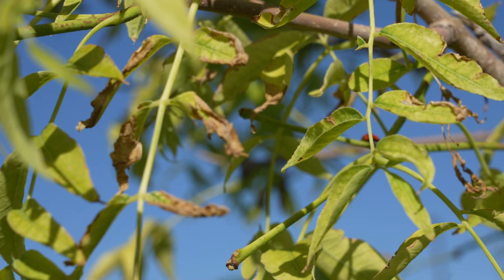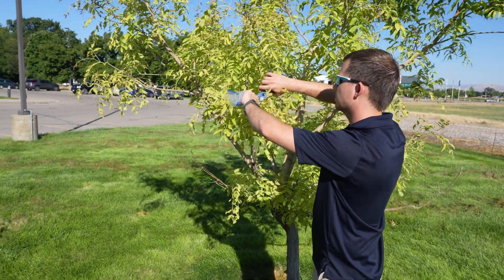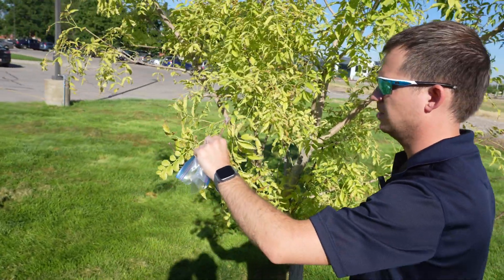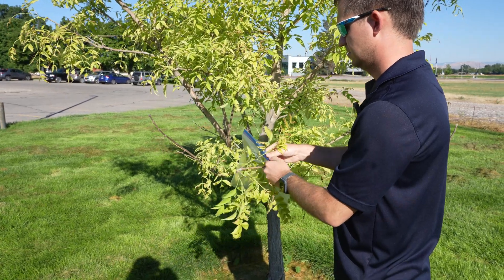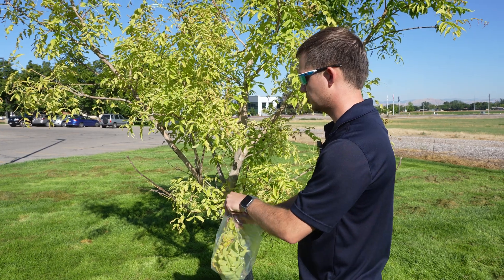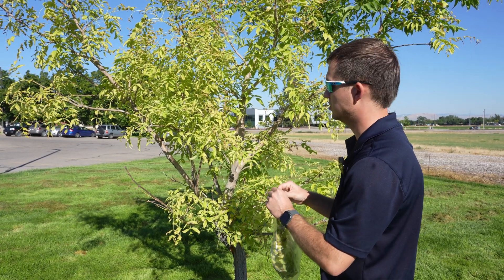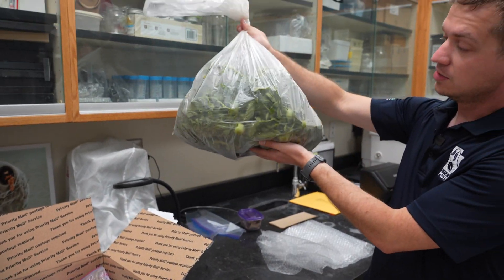For most samples, place the tissues in a sealed plastic bag. Do not add in a wet paper towel, as this can cause mold growth and ruin the possibilities of an effective diagnostic test. Make sure there is not any excessive moisture in the bag. Seal the bag. Never send samples if they are not sealed in a plastic bag, as we cannot run most diagnostic services on plants that have dried up in the mail. For larger samples, sealing as much as possible in a trash bag is recommended.